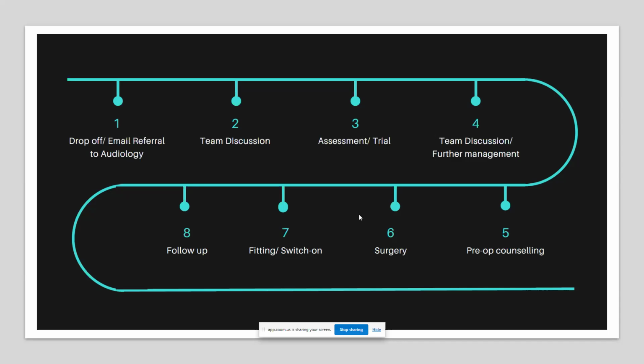Then they have the surgery, and 3 to 4 weeks after the surgery, depending on how they are healing, the switch on will happen, or the fitting of the actual processor will happen, and then we will follow them up as per protocol.